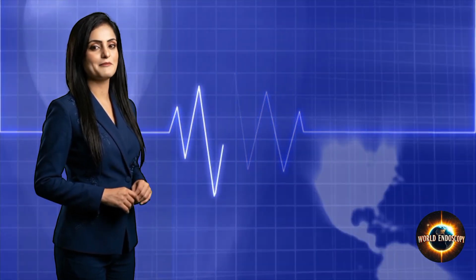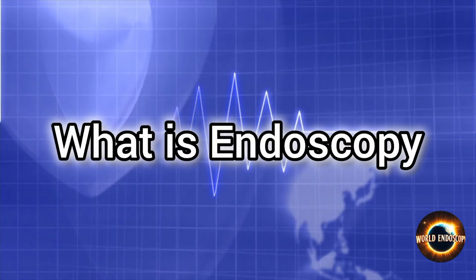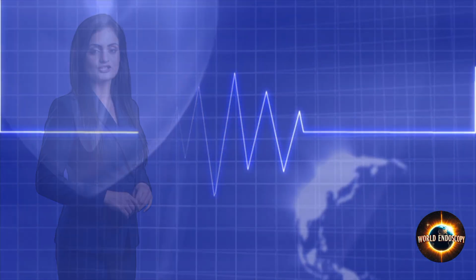Today we will learn about the major types of endoscopy procedures. This lecture is designed to be short and easy to understand. Endoscopy is a medical procedure that uses a camera to look inside the body. It allows doctors to directly examine internal organs. It is used for both diagnosis and treatment.